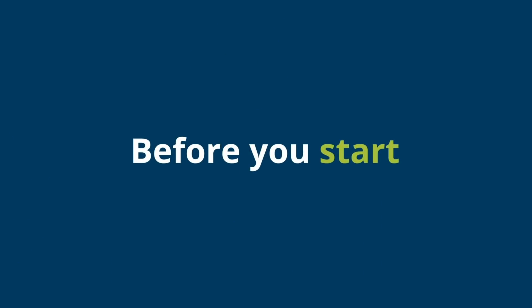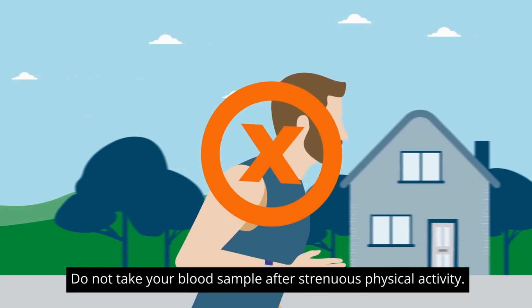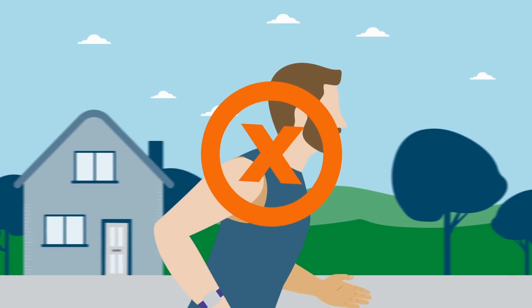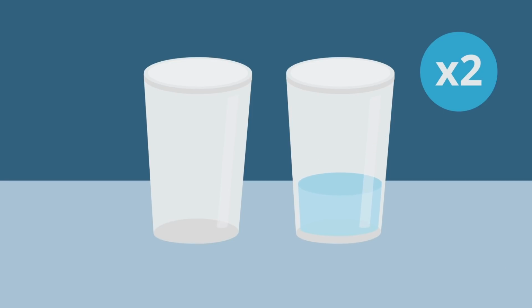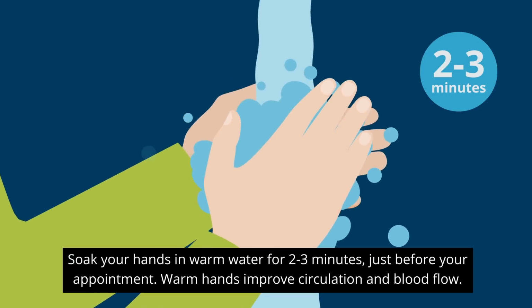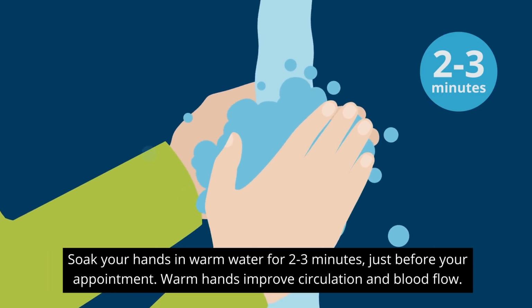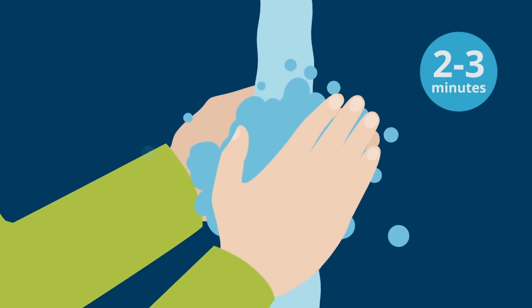Before you start, do not take your blood sample after strenuous physical activity. Drink at least 2 large glasses of water before your appointment if you can. Soak your hands in warm water for 2 to 3 minutes just before your appointment. Warm hands improve circulation and blood flow.